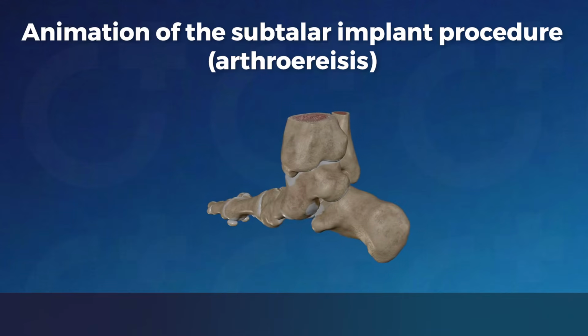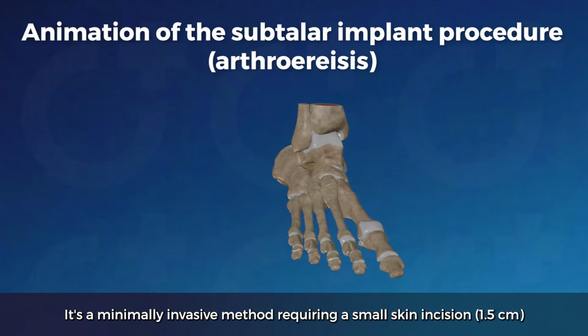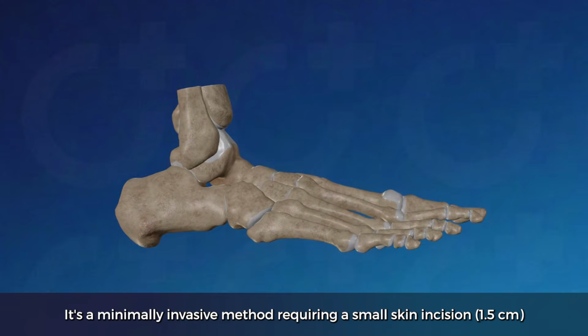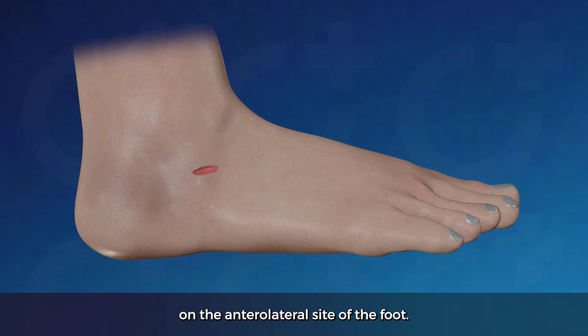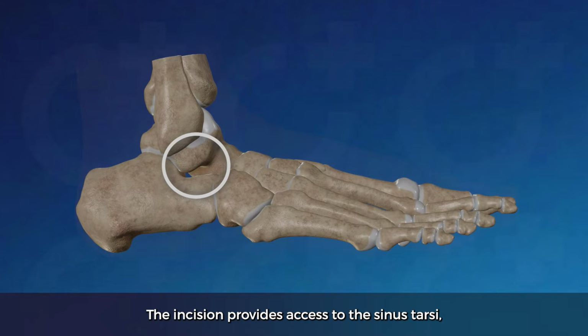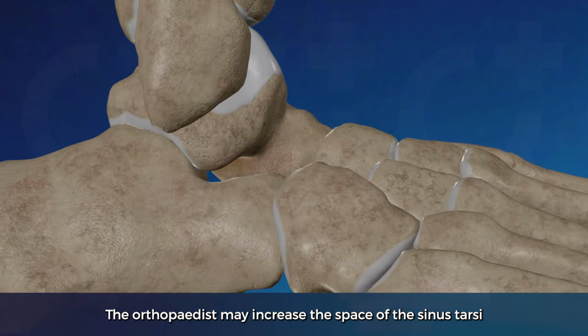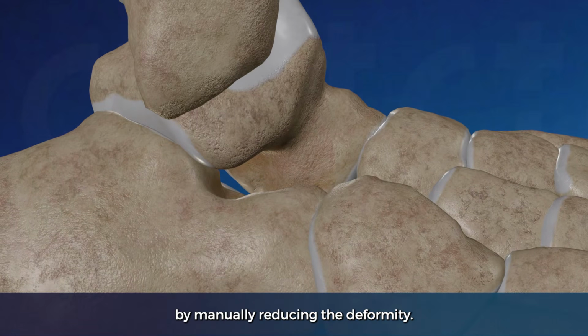Simplified animation of the subtalar implant procedure, arthroereisis. It's a minimally invasive method requiring a small skin incision up to 1.5 cm on the anterolateral side of the foot. The incision provides access to the sinus tarsi, the cylindrical canal between the talus and calcaneus. The orthopaedist may increase the space of the sinus tarsi by manually reducing the deformity.